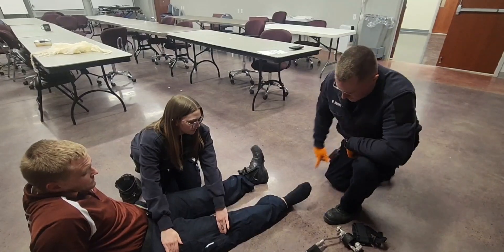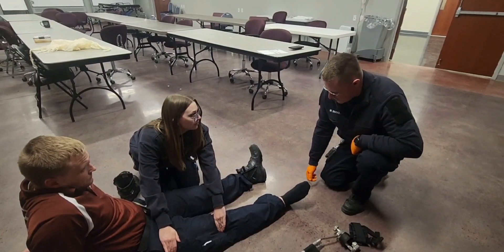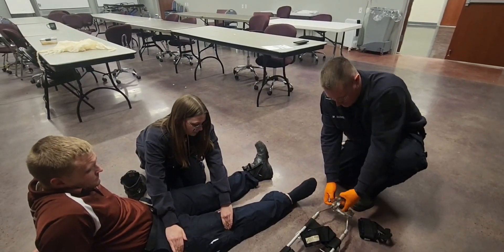I'm then going to check sensory, motor, and circulatory functions. I do have a strong pedal pulse. Go ahead and move your toes — thank you — and close your eyes. Inside or outside of the foot? Inside. Pulse, sensory, and motor functions are intact.